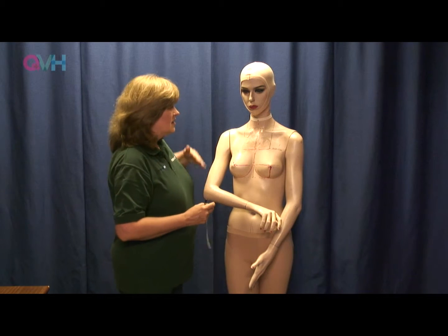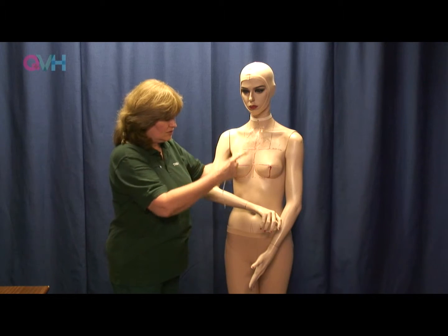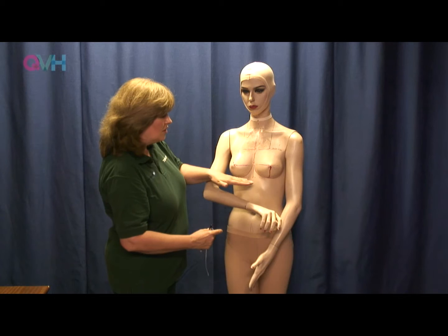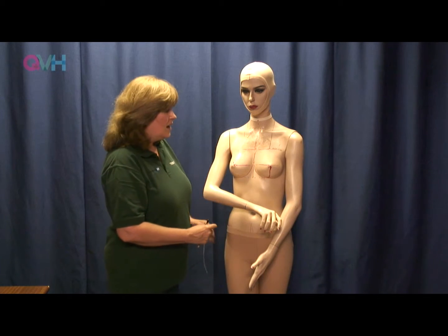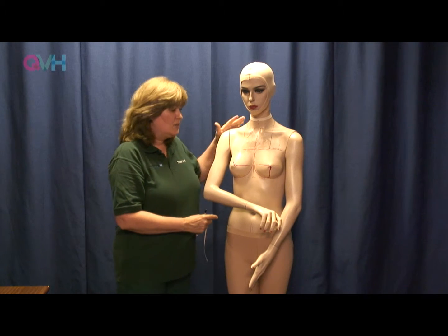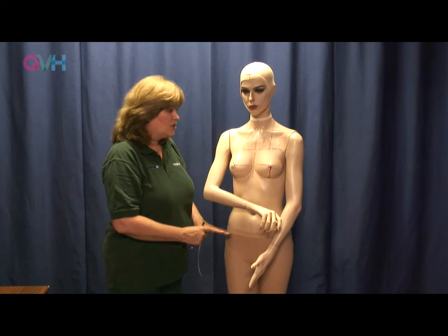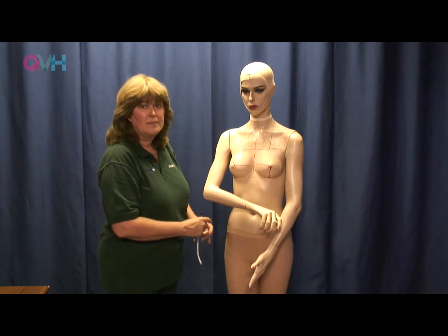I tend to look at it as measuring all the circumferences of the central torso. I would start at the neck and then measure each one, leaving a mark. As you see, this mannequin is already marked as we go down. These measurements will apply to measuring a man and a child, and then we'll come back later to the specifics of measuring a woman's breasts. So while we're just thinking of measuring a male, a female or a child, we'll just go through the steps in order.